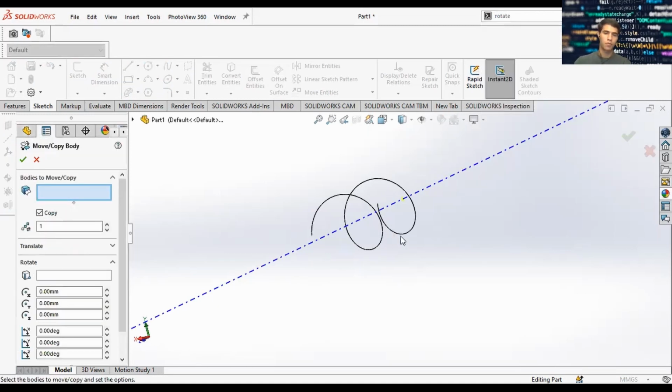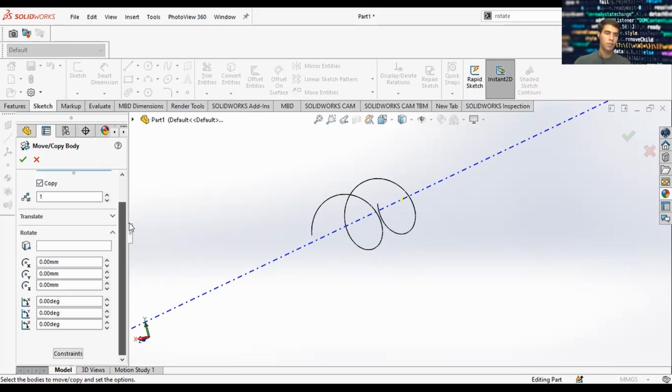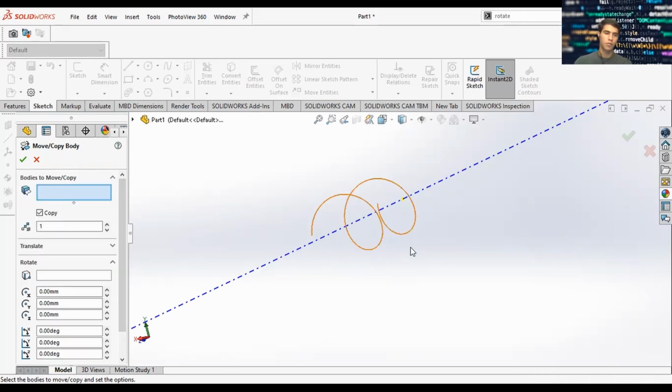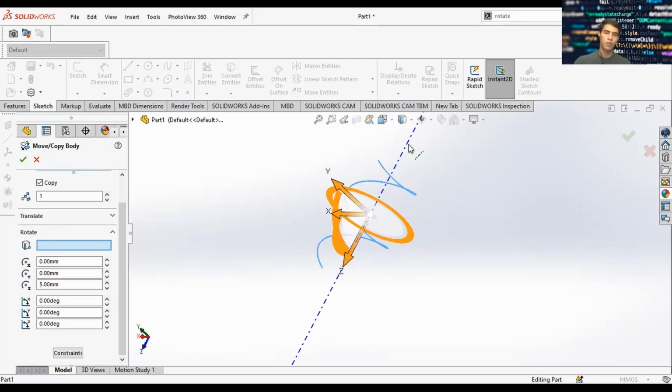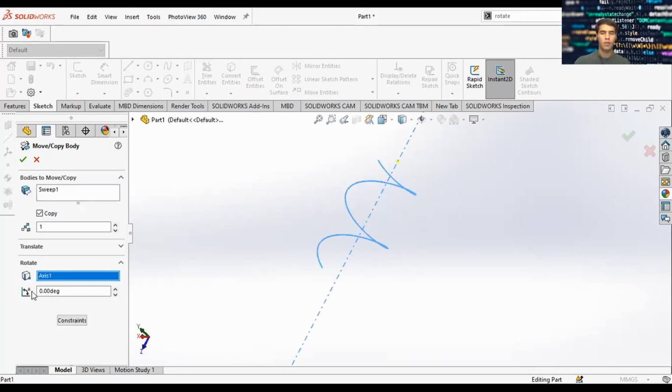Which one do you want to move? I want to move this one. Sweep number 1. I want to rotate it around this axis. And here, just do some basic maths. I'm going to grab my calculator.